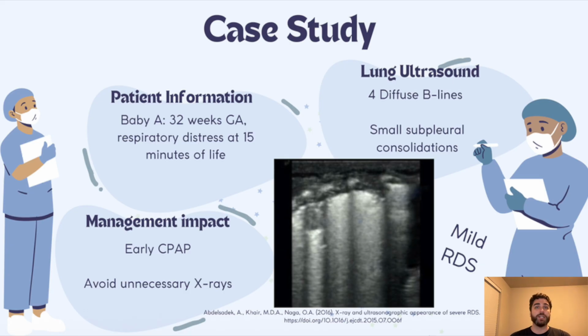And so based on these findings, the team then starts early CPAP rather than escalating a little too aggressively to intubation or anything else. Several scans over the next 2 hours show improvement in the patient, confirming that the infant responded very well to CPAP. The infant then stayed on that throughout the course of their NICU stay and was slowly weaned off. So great. You kind of saw that little bit of process of how that would work, what the clinicians are thinking through when they are looking at lung ultrasounds.